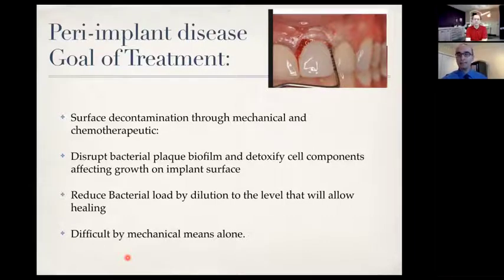My focus in this presentation is to raise awareness among practitioners who are doing implant dentistry or having patients with implants in their mouth. Because as I mentioned, if we can catch these problems at the level of peri-implant mucositis, we can prevent the problems down the road. Peri-implant mucositis can be non-surgically managed by having a proper debridement around the implants with the specific tools dedicated for implants.